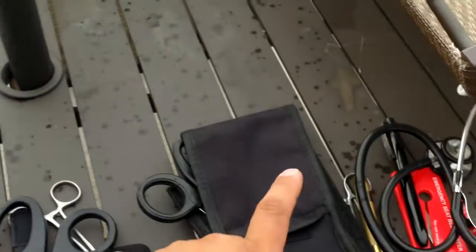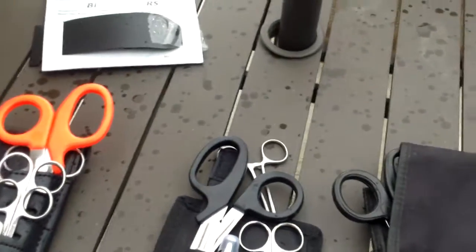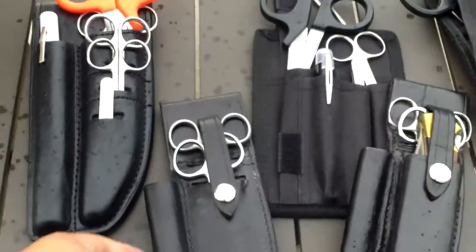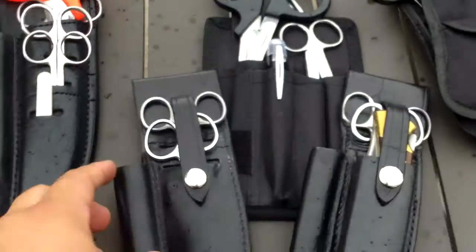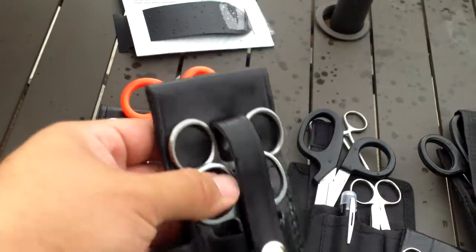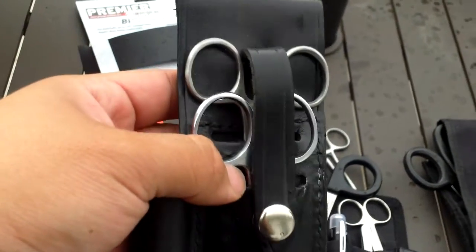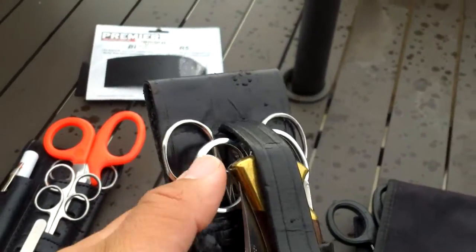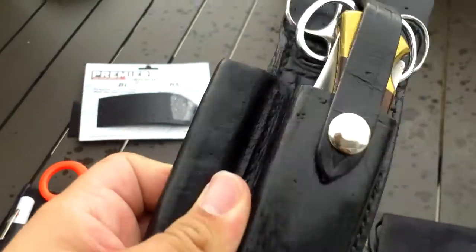This one is $30, this one on the website is $70 but in store I've only ever seen them for $50, and these ones are about $25. Here are a couple that are not really on the market much — vintage Tech Shoemaker ones from the 70s and 80s. This one just has two slots for shears and a pen light; I carry the clamps, the bandage shears, and a pen light. This other one has the clamps, bandage shears, pocket knife — which is a nice addition — and then the pen light.